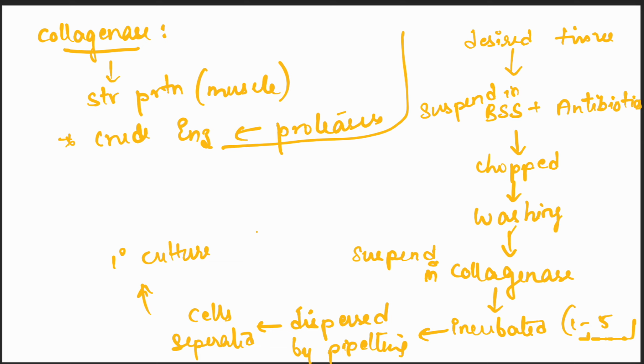The tissues mostly preferred for this enzyme are human brain, lungs, and several epithelial tissues.